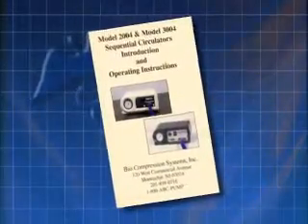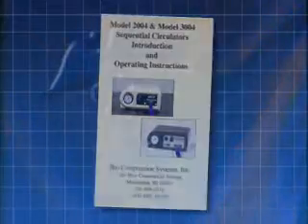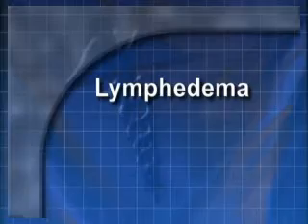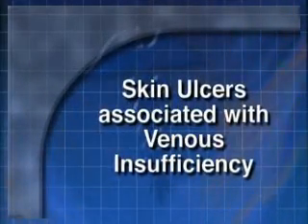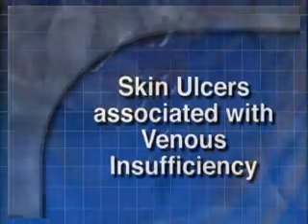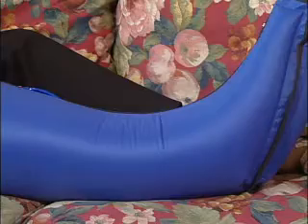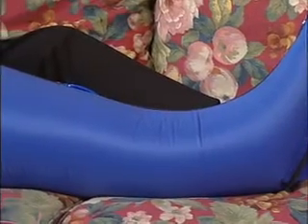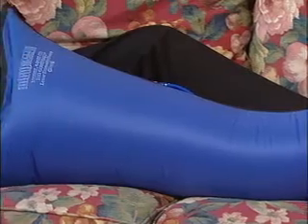In all cases, we recommend that you carefully review the operator's manual included with your system to completely familiarize yourself with its operation. Your physician prescribed the use of this device for treatment of either lymphedema, swelling of the arms or legs, or skin ulcers associated with venous insufficiency. This device provides a deep tissue massage that helps to increase circulation. This massaging action moves the fluid out of the extremity and into the region of the circulatory system where it can be eliminated from the body.